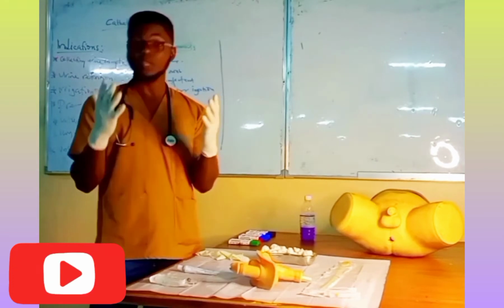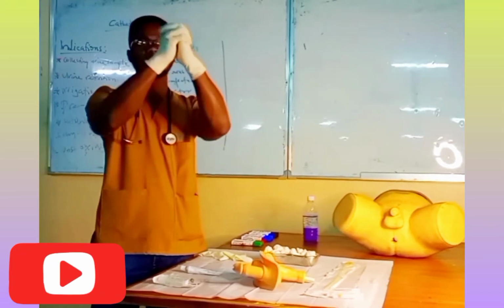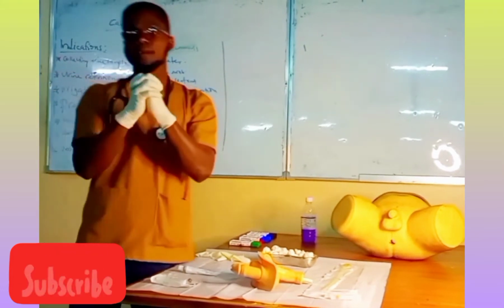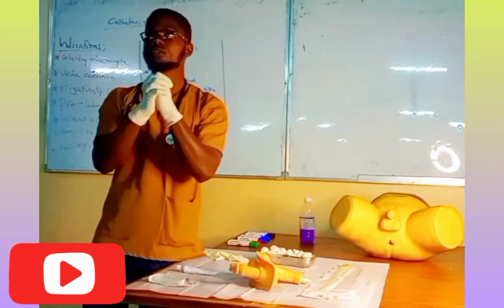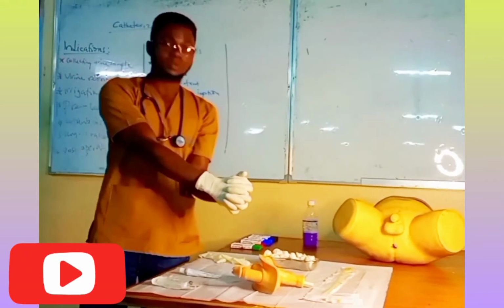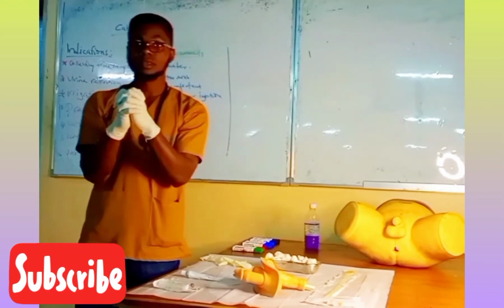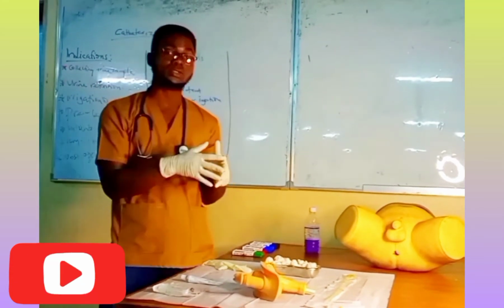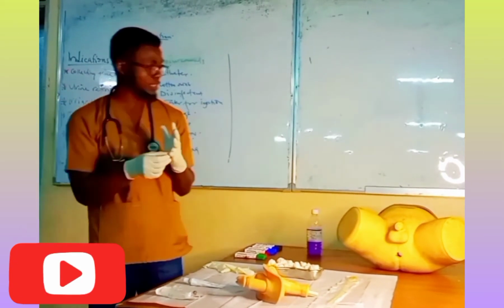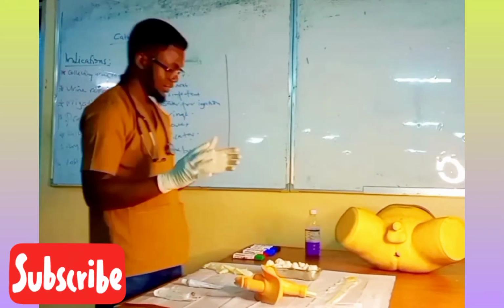After putting on my gloves, I hold my hands like this. Why am I holding my hands? It's not a punishment, but I'm trying to control cross-contamination and transfer of infections, either from my body to the patient or from the surroundings to the patient. Are we together? Yes, because the procedure I'm going to do is a sterile procedure. So I'm going to start with the disinfecting part, and I'm going to have my assistant come here.